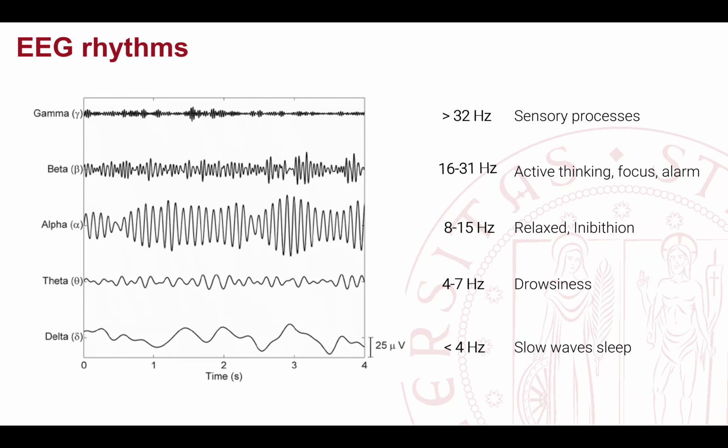And normally there are also other studies that associate the position of this peak, for example, to age. Children normally have this peak at a higher frequency, so closer to 15 hertz, while elderly have this frequency closer to the low frequency, closer to 8 hertz. But again, in grand average, so you may find an elderly subject with 15 hertz, one with 8 hertz, and on average, they are slower than the children. So it is person specific.